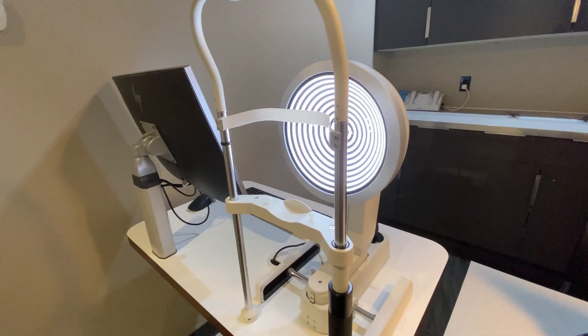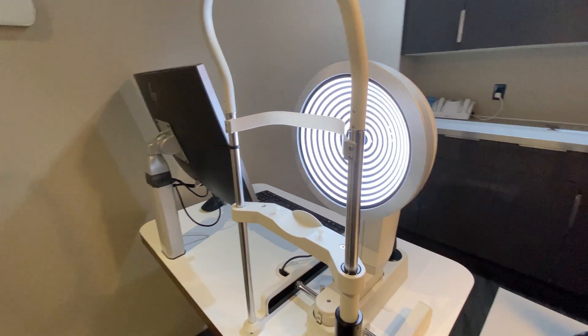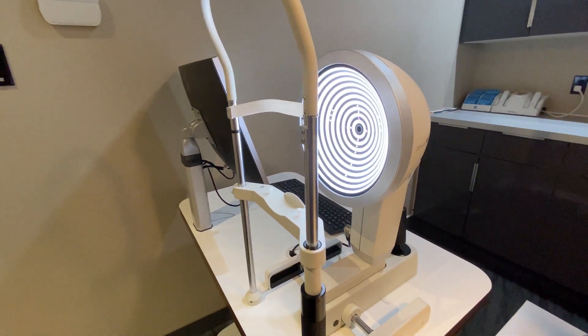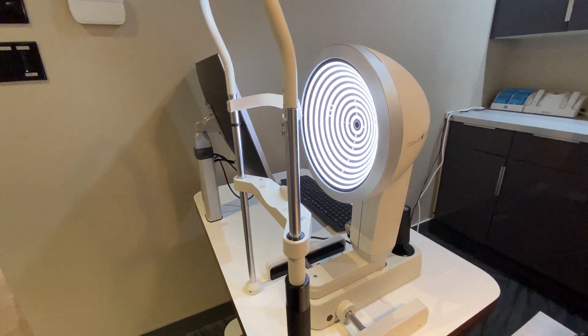Diagnostics are also crucial in determining the progress on particular treatments we have chosen for that type of dry eye. In this video, we will focus on the Oculus Keratograph 5M and some of the ways we use it in diagnostics for dry eyes and monitoring our treatment.